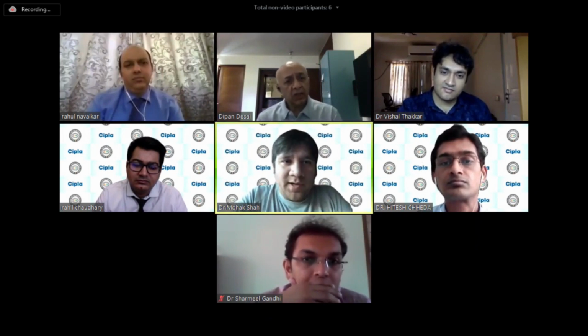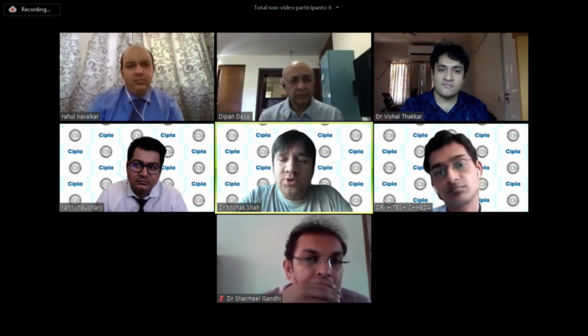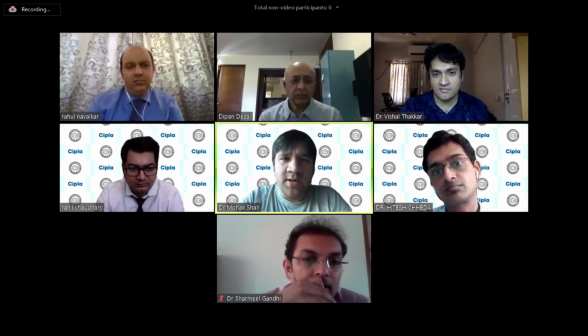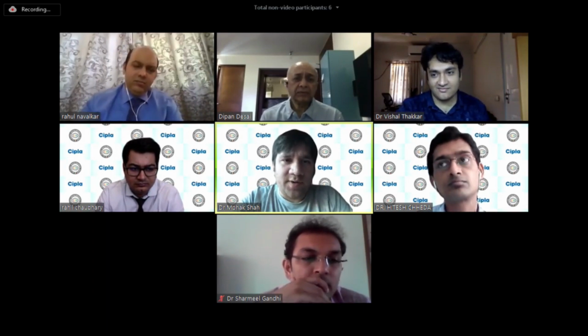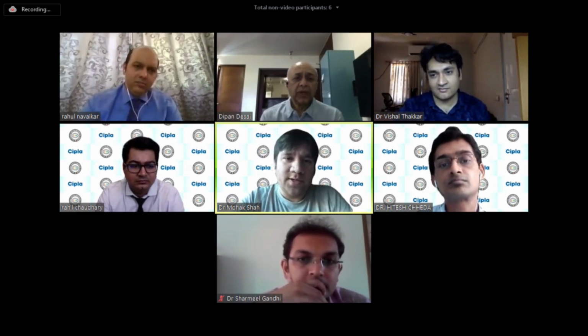Actually, I've stopped putting ultrasmart torics, but nowadays I've got very good experience with the Biotech lenses. Yes, they are very good lenses as an Indian company. I am also using a lot of toric ICLs as well, and I'm getting results as good as the imported ones. So I would suggest if you have to use one Indian company's IOL, it would be Biotech. Of course, there is no financial interest, but so far we have put in more than 500 lenses, and our experience has been very good, spot on. It is always around 0.5 or 0.25 residual.